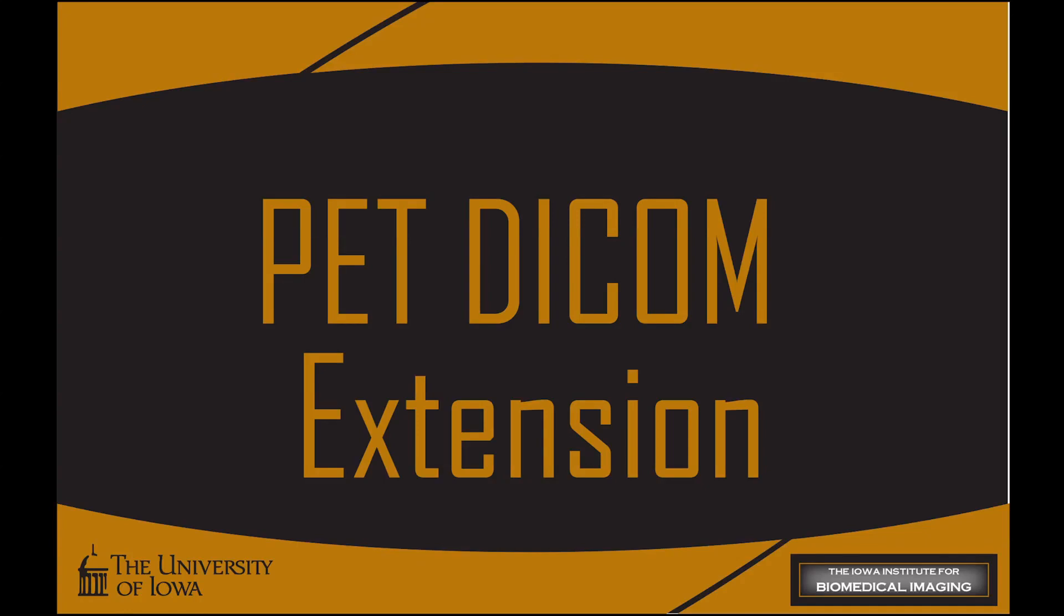This video will take a look at the PET-DICOM extension for 3DSlicer, a multi-platform, free and open-source software package for visualization and medical image computing.